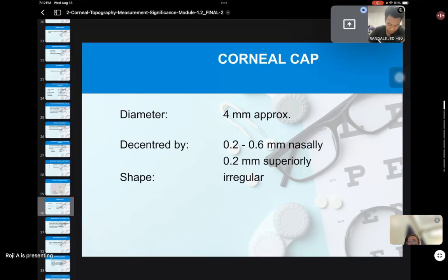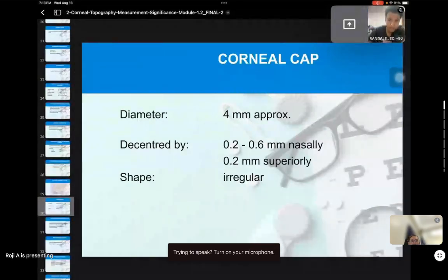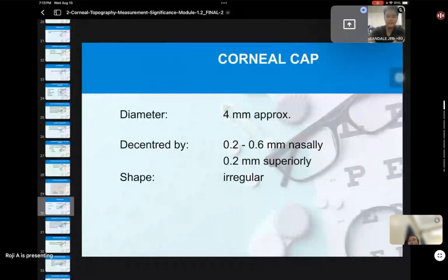Okay. And there's a decentration, from the word decentered. What does that mean when I say decentered? Like, my mind is decentered, I'm not focused. What does that mean? It means it is not the exact center. It's away from the center. Guys, it's so easy, right?